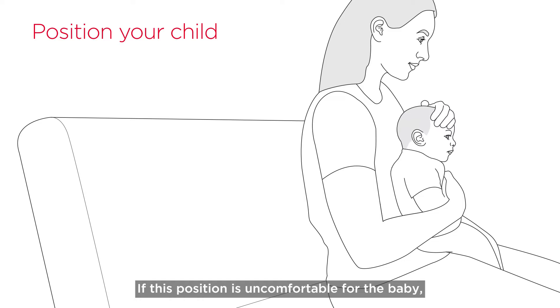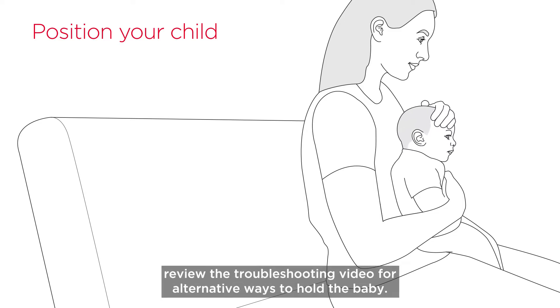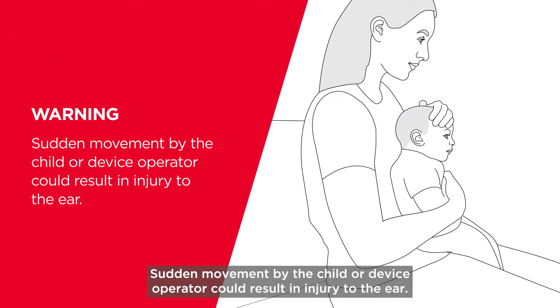If this position is uncomfortable for the baby, review the troubleshooting video for alternative ways to hold the baby. Sudden movement by the child or device operator could result in injury to the ear.